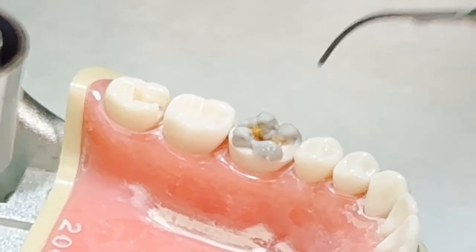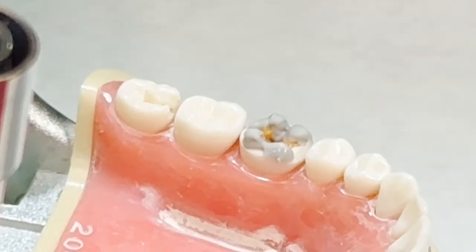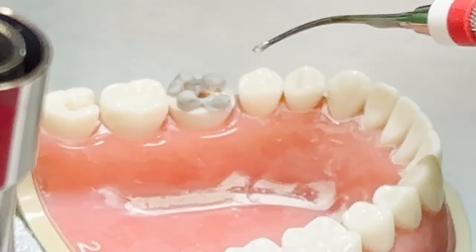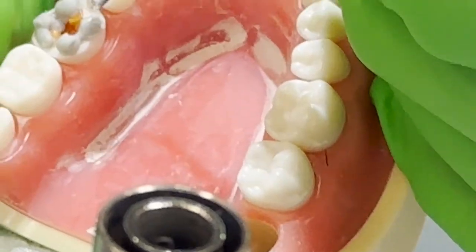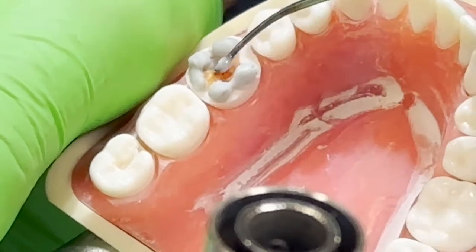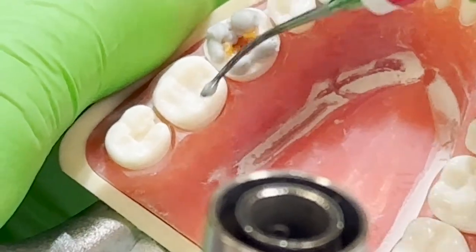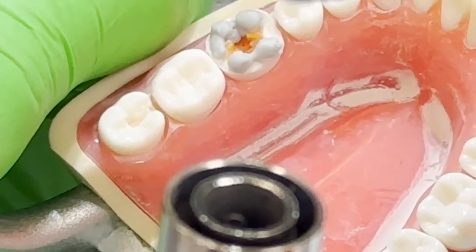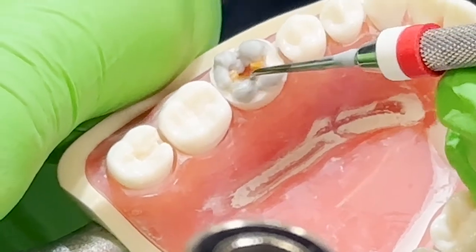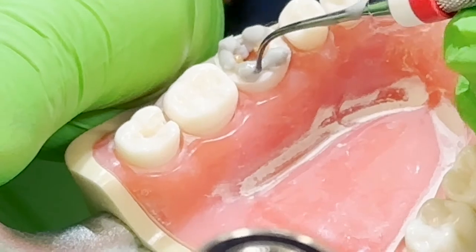If anybody has questions as we're doing this, don't hesitate to speak up. So as I'm looking here, I want to make sure I look down the occlusal line and I can see that these cusp tips are in line with your other cusps. Okay, again, you don't want them too far out. You don't want them too close. Just want them just right, okay?